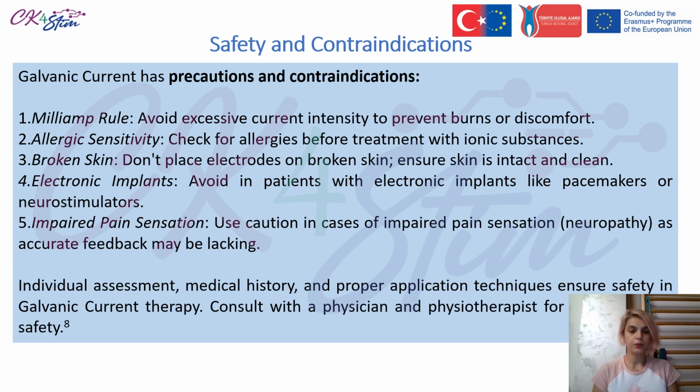Electronic implants: we should definitely be careful and avoid the application of the treatment with electronic implants like pacemakers or neurostimulators. Impaired pain sensation: we should be very careful of impaired pain sensation, as in neuropathy, because we will not have accurate feedback if there is a lack of sensibility.